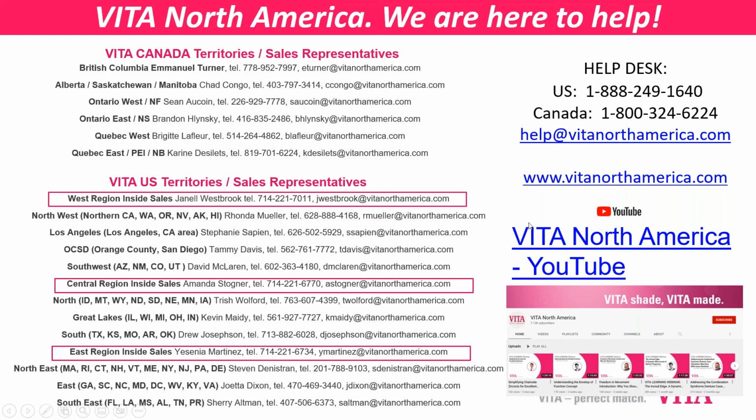I'm trying to use model analysis to set the teeth in that architecture of their body better, and then using the key phonetics to try and ascertain if that's right for them, following the golden proportion rule.